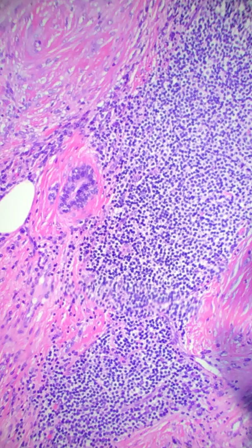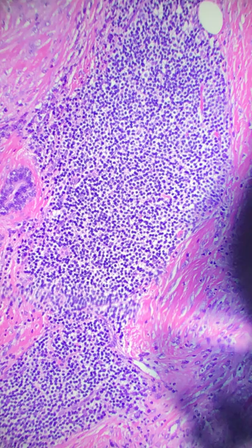They tend to have chronic inflammation, okay? So if you're driving around these things and you see areas of lymphocytic focuses or dendritic cells, that's not uncommon with these. You often will find that.